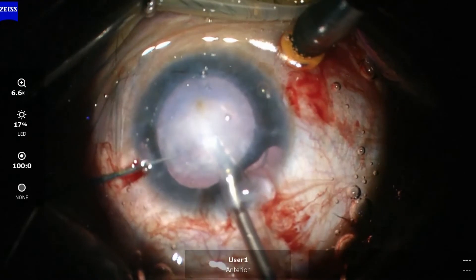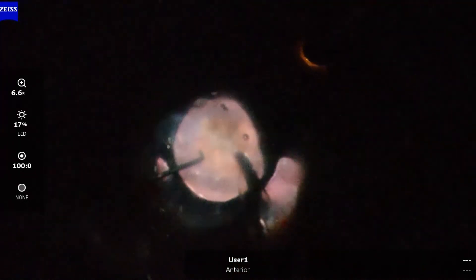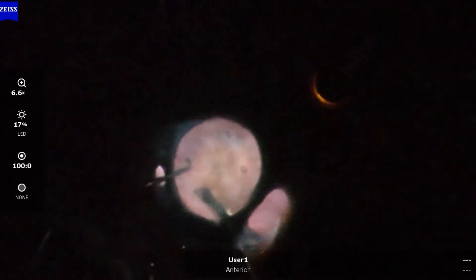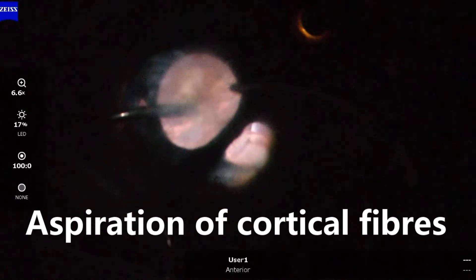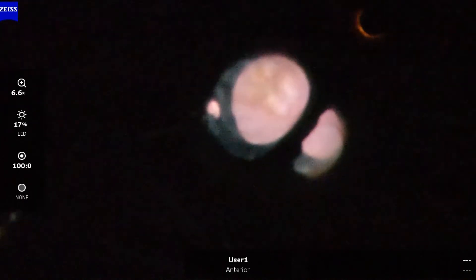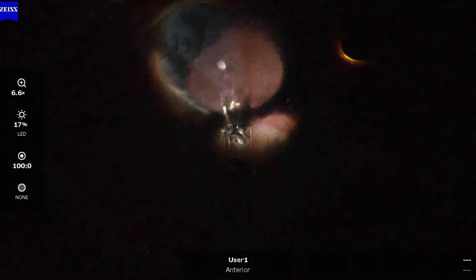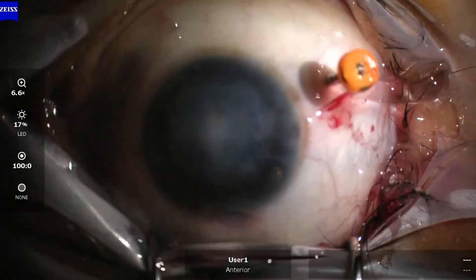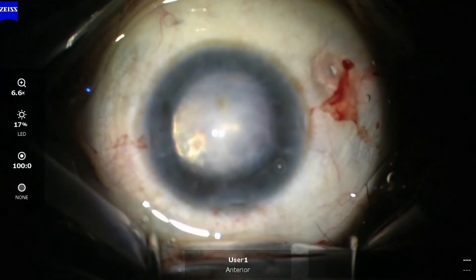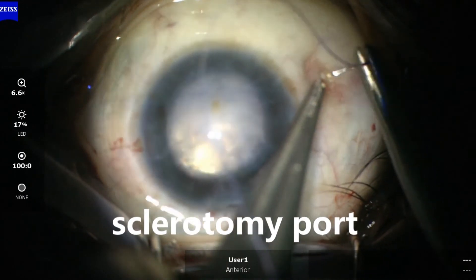Nucleus fragmentation and phacoemulsification were done by chandelier assistance with the operating microscope light switched off. Bimanual irrigation and aspiration were done by retroillumination from the chandelier. IOL was implanted under retroillumination. Sclerotomy port was closed and wounds sutured to maintain water-tightness.